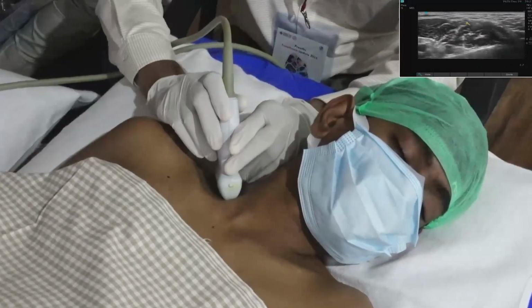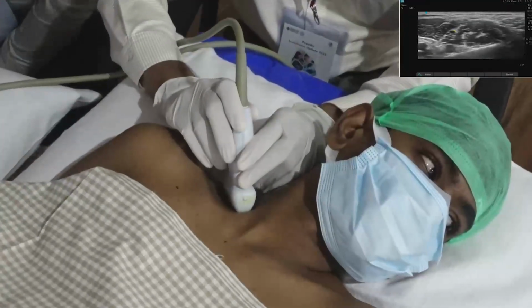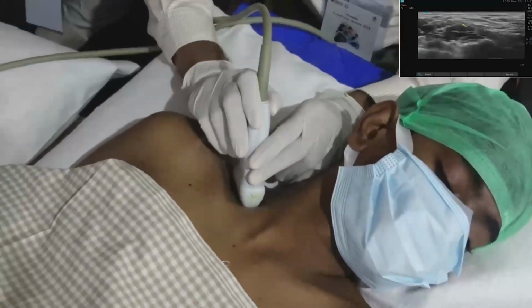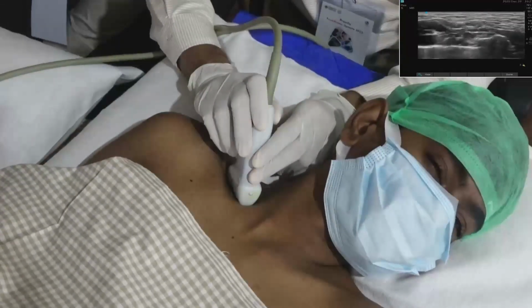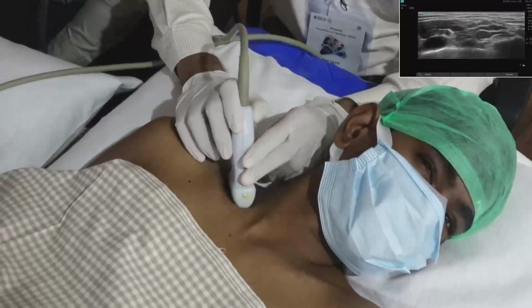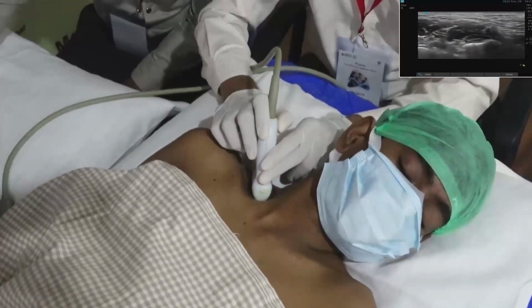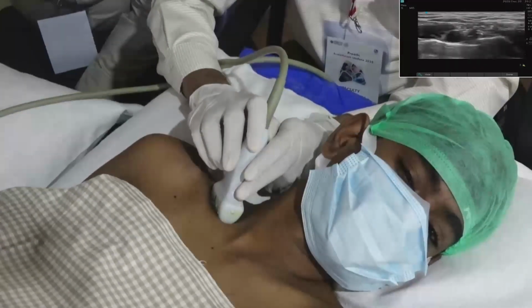This is a place between the two scalene muscles. Here it is very important to identify the individual nerve root or ventral rami. So we have to identify the transverse process unique morphology, which starts from C7 has unique morphology and C6 has unique morphology.